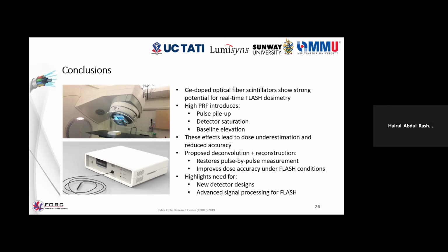This has led us to observe dose underestimation and reduced accuracy, leading us to propose a deconvolution and reconstruction of the pulses approach to improve the accuracy. And we see some potential for more work, especially in the detector approach, some advanced processing, and also even the materials used for dosimetry.